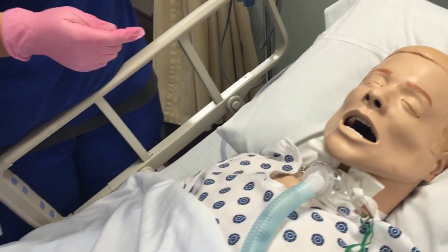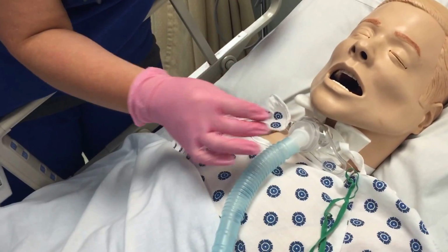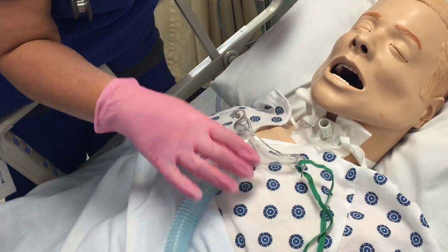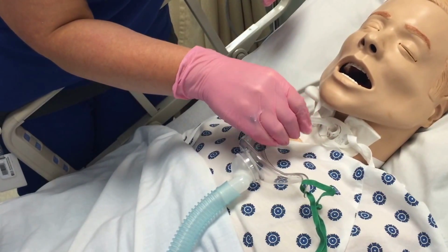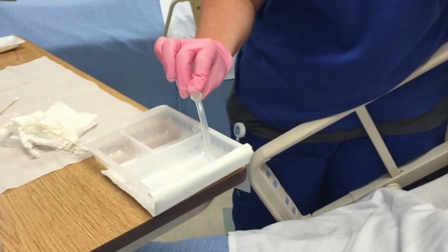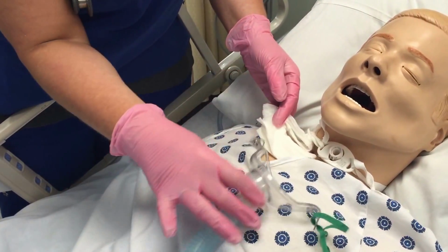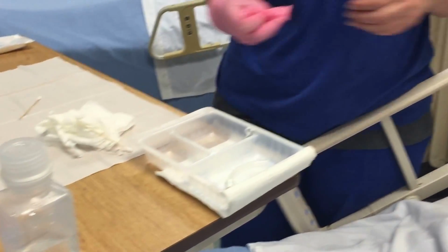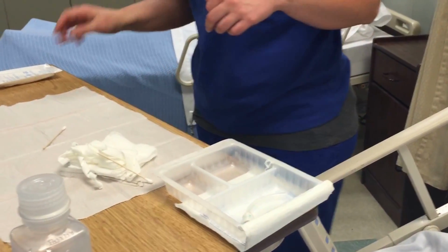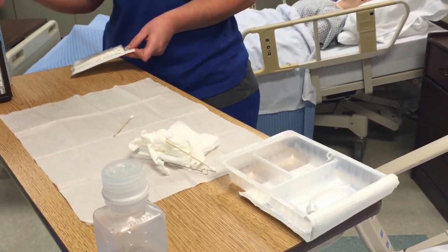Alrighty. Okay, so I'm giving you some oxygen. You've been taking those deep breaths still from your gut and suctioning, right? All right, I'm gonna take it away for just a little bit, okay? I'm gonna just take this little inner cannula out. Okay, so you're gonna untwist here and then just pull straight out, not letting that inner cannula touch anything. Just come straight out, and then you're just gonna drop it into the first bin. Okay, and then you're going to take this out, the drain sponge, and it's going to go into the trash. Okay, all right, and that's it. Now, it's going to be sterile again. And wash my hands.